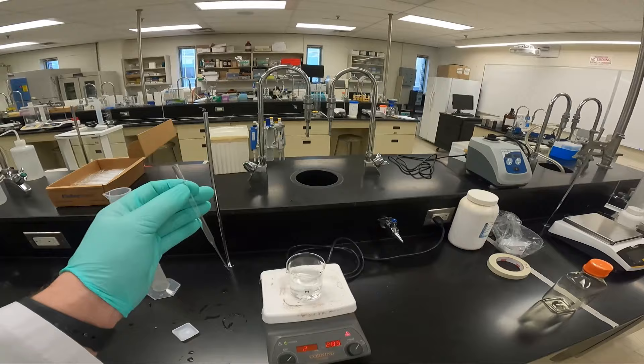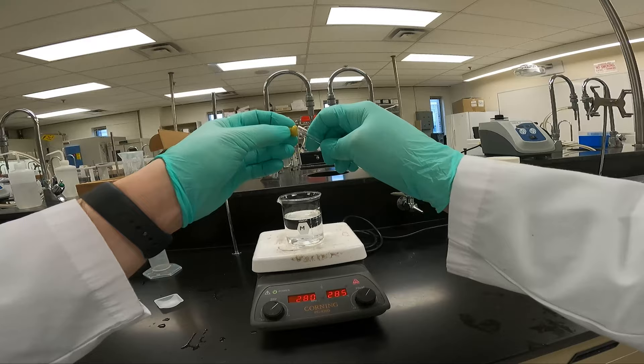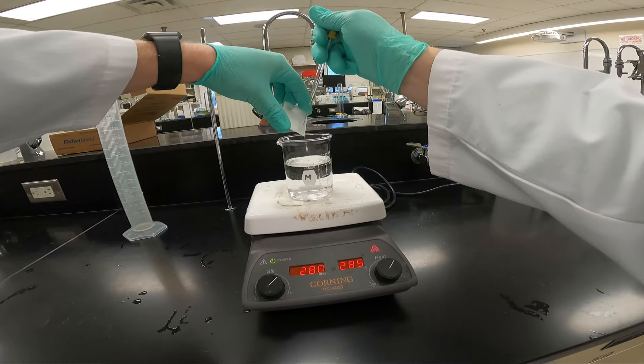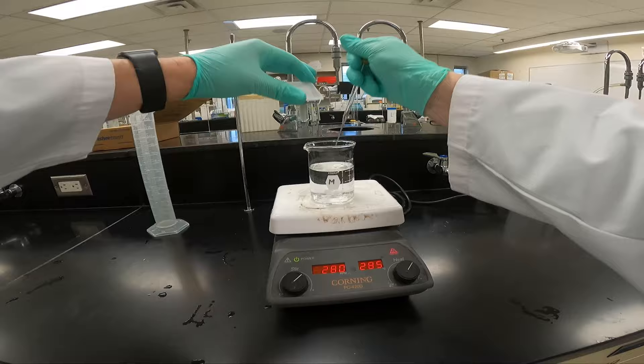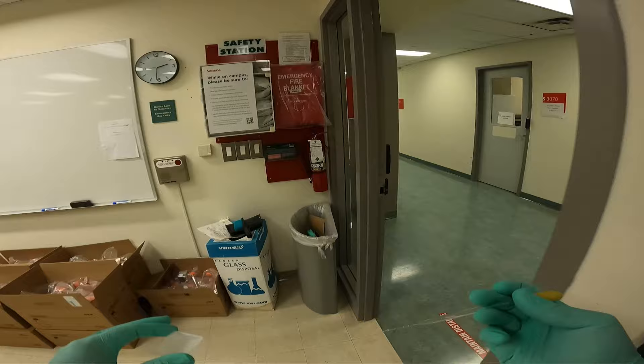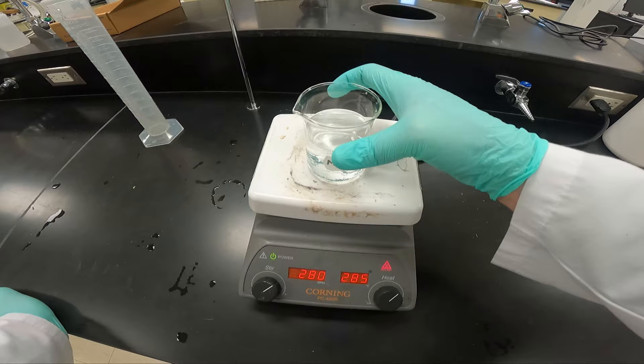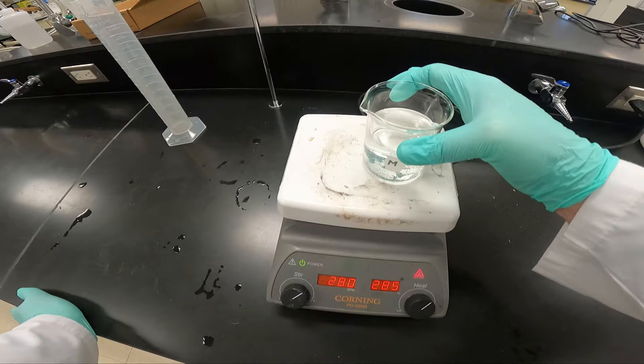I will now place my beaker on my hot plate — it is warmed up. I will suck up some solution and place it in with the powdered EDTA to make sure I get all the powder into the actual beaker. Once again, EDTA will not dissolve into the solution at room temperature. I am going to heat it up. It will only take a minute or two, once it heats up, to dissolve completely.